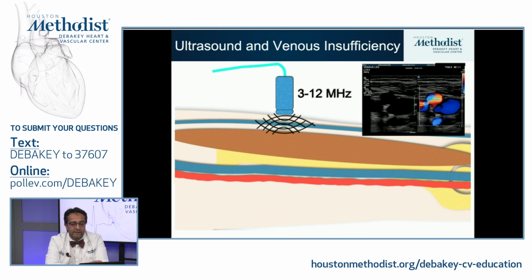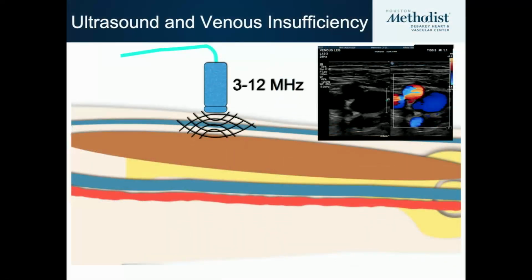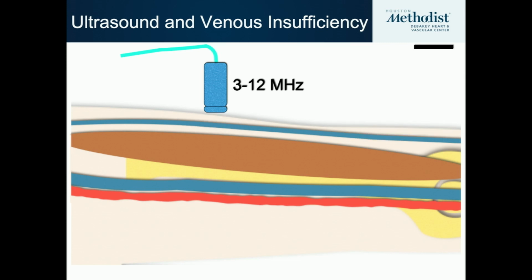This is an example of this kind of ultrasound, in which we see about 3 centimeters in depth. We can see that in the slide, and it's a clear image. And if you use the Doppler and the computerized conversion to color, you can see the colors on the right side of the screen. And this image represents that. But what I was mentioning is that the waves don't bounce like that. As a matter of fact, the waves keep going down.